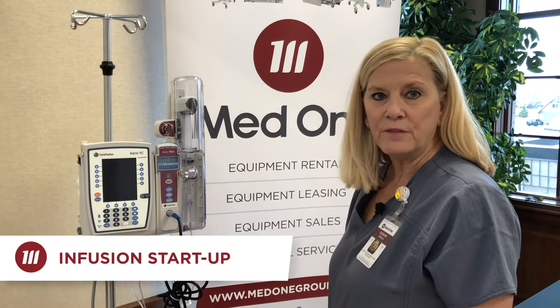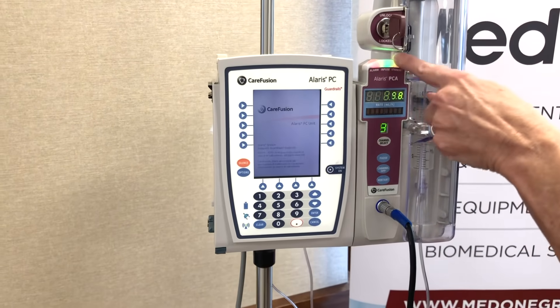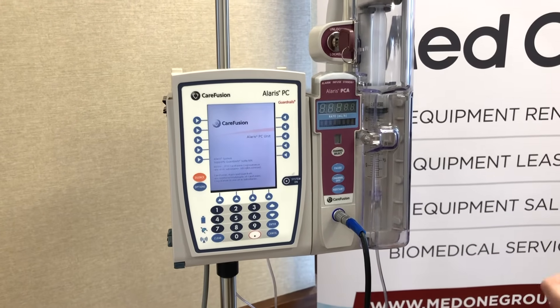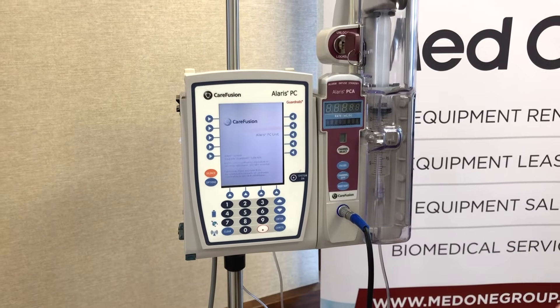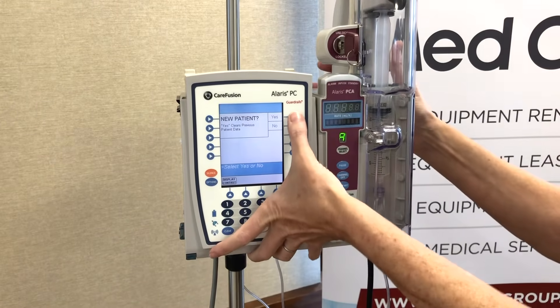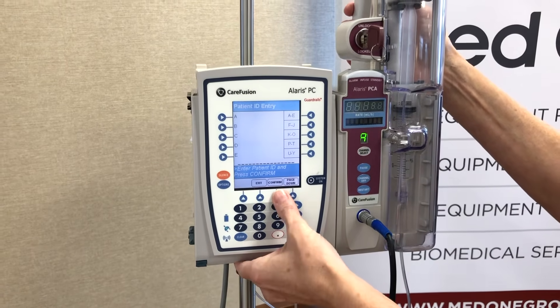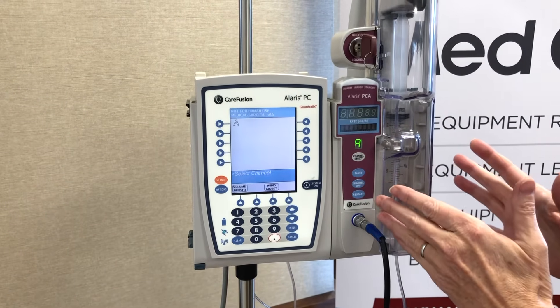Now we're ready to start an infusion. I'm going to reach out to the system on key and turn it on. You'll notice some lights lighting up on the PCA, just indicating that connectivity between the PCU and the PCA is intact. The first clinical question it's going to ask you is: is this a new patient? Using the arrow keys that correspond to the screen, look for the answer you want. In this case, yes — this is a new patient. It will default to the last profile used, which is med-surg, and that is what I want for this scenario.